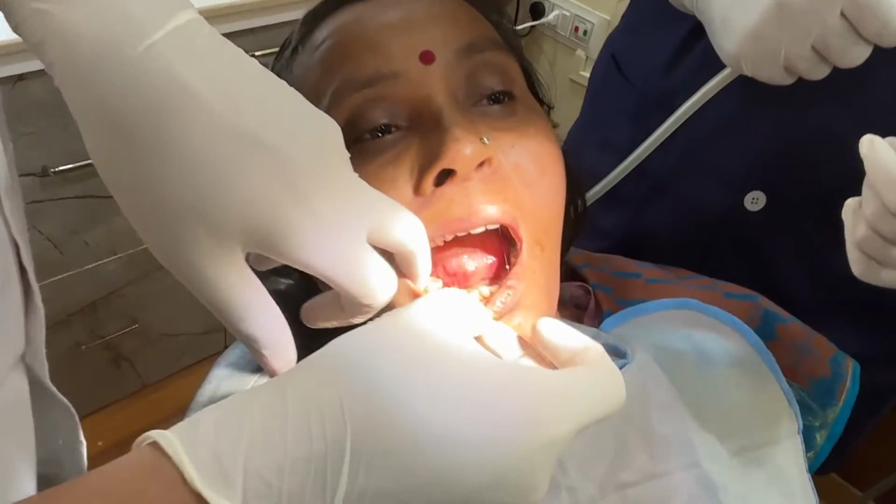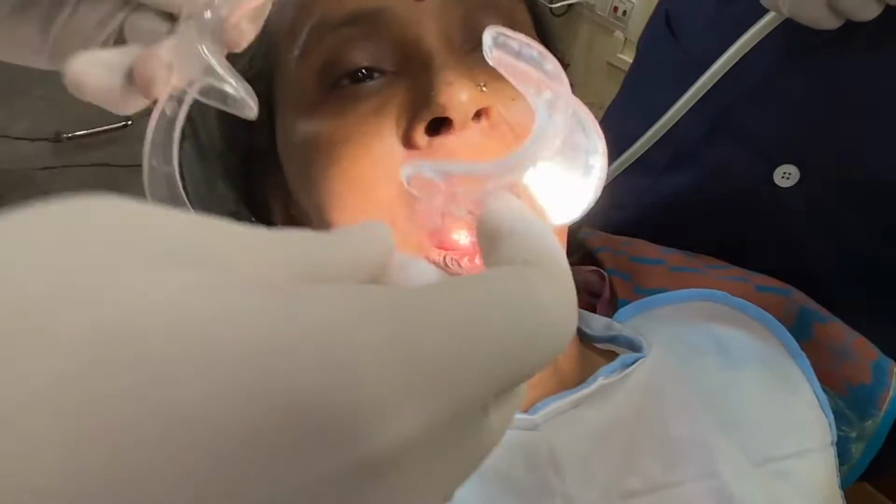I have given local anesthetic solution. I have infiltrated the area before. Now I will place the cheek retractor.